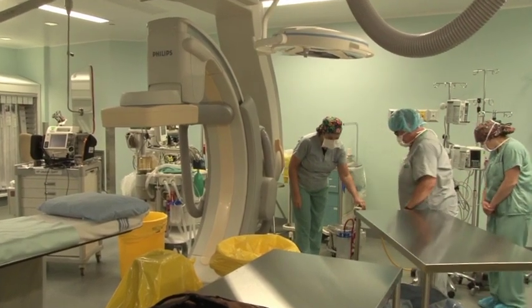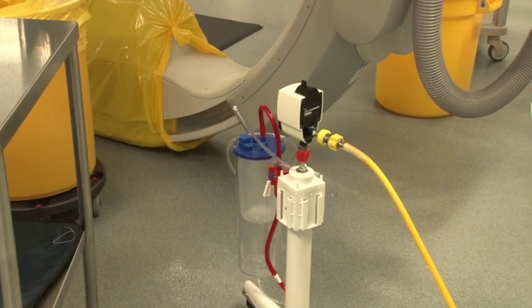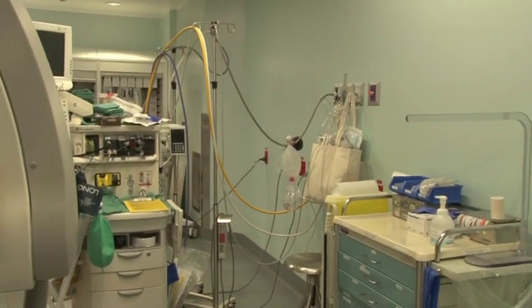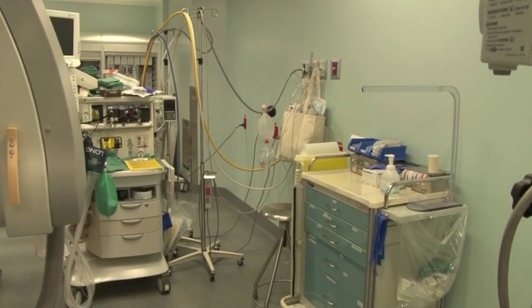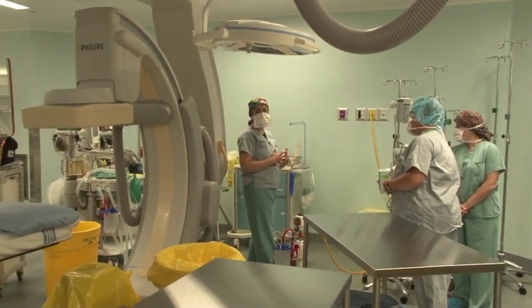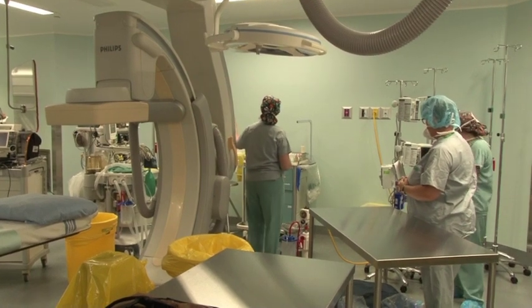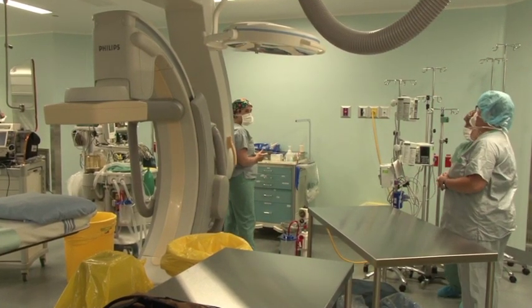And we have our suction here. It's on this portable cart. We don't actually have one on the wall. We use it here on the cart so that we're closer to the patient. Okay. Behind here is the anesthesia corner, and anesthesia has their own emergency anesthesia cart. They also have their monitor, and if we needed to give a patient a general anesthetic, we have a whole setup here for anesthesia. We keep over here our emergency ambu bag and any extra oxygen tube.